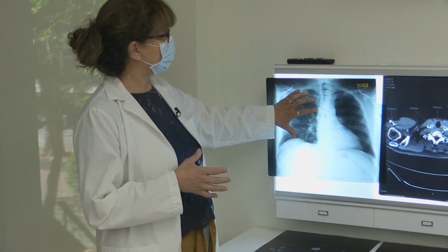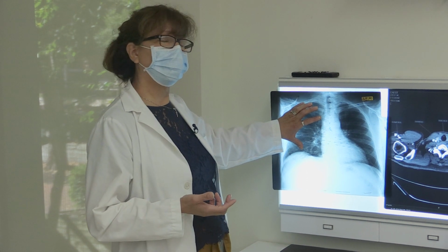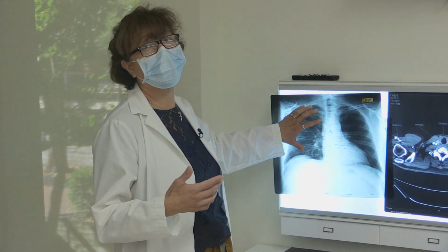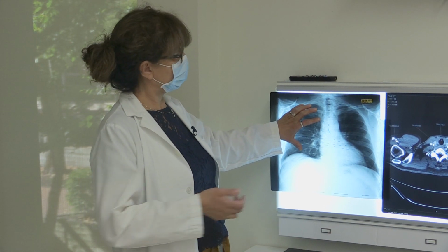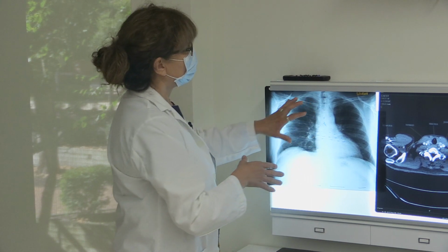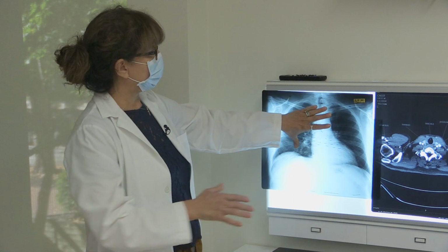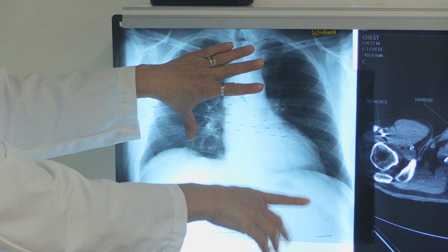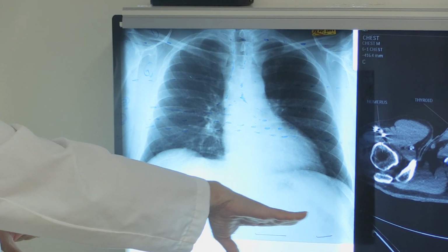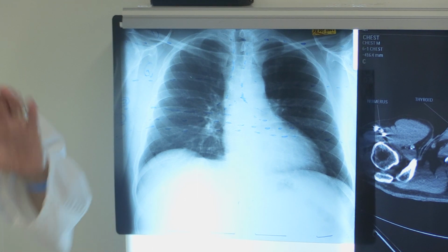When we scan, we can start with the patient either feet first or head first into the scanner, depending on what studies you are performing on that patient or if the patient is a trauma patient. Obviously, you will set up a scout for your scan, and you want to start at the very top of the chest, and the scan normally ends at the very bottom of the chest, but you want to include the adrenal glands, which are sitting on top of the kidneys.